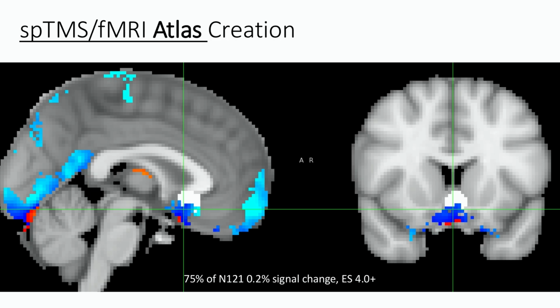It's kind of localized and circumscribed around the subgenual cingulate. And not only the subgenual cingulate, right? We really care about some of those other brain regions that, when you do this guided targeting, you get an evoked response in these distributed circuits. So let's throw those out in the world. Let's make a minimum threshold of the strength of activation and the number of people that have consistent activation in that direction, and publish that in case somebody wants to use that and relate it to a clinical response.